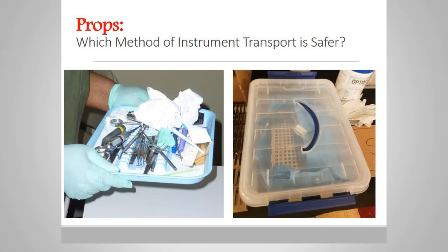So once again, I recommend that you look at the regulations in your area and make sure that you are indeed in compliance, and if in doubt at all, provide a leak-proof covered container as you see on the right-hand side.